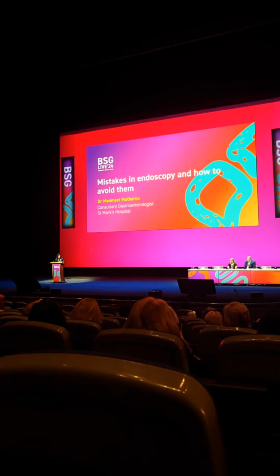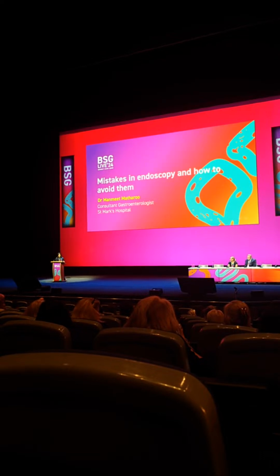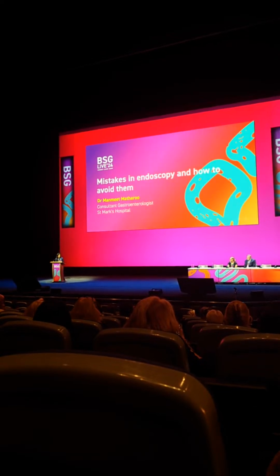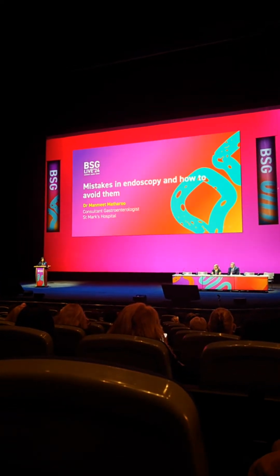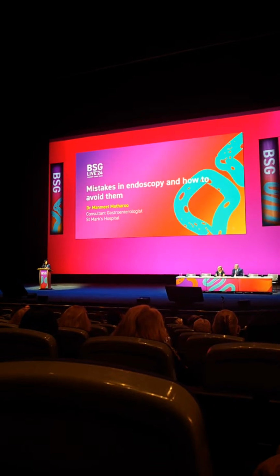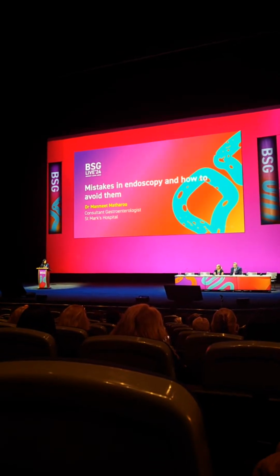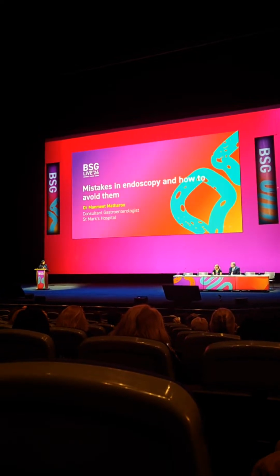we're getting patients through straight to test pathway. I think the key is things can change from the referral to the point when the patient comes for endoscopy. So if the clinical situation has changed and they may have had a stroke in the intervening period, for example, you're going to need to amend that endoscopic indication. So I think it's about a team approach and education of colleagues.